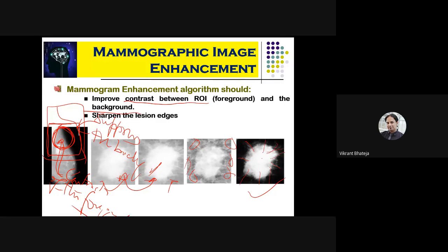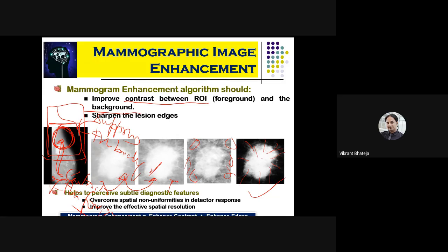You can see that the edges have become very, very clear over here, which are predictive of malignancy. If such enhancement algorithms are applied to medical images, they help improve problems due to the malfunctionalities of the X-ray detector. It improves the contrast and also the effective spatial resolution. So when we say mammogram enhancement, we are enhancing the contrast and we are also enhancing the edges over here.